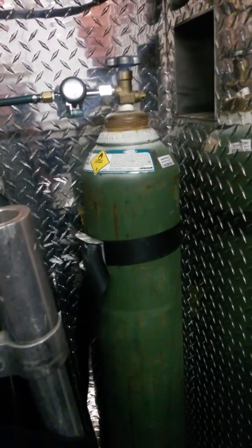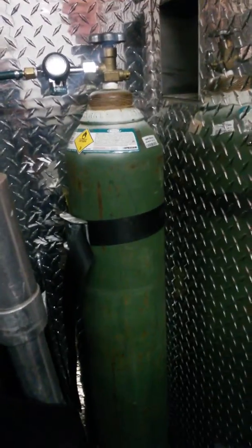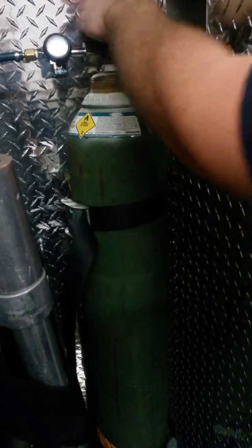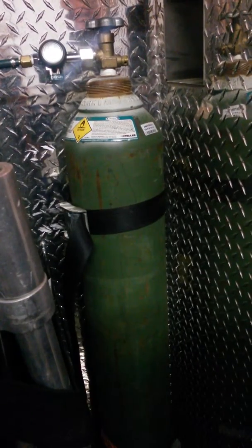Everybody here should be able to fasten an oxygen bottle into the ambulance. Don't take shortcuts and just tie it up so you can go back to doing whatever you're doing. Put it on right for your safety and everybody else's.